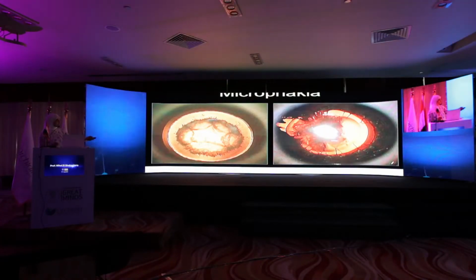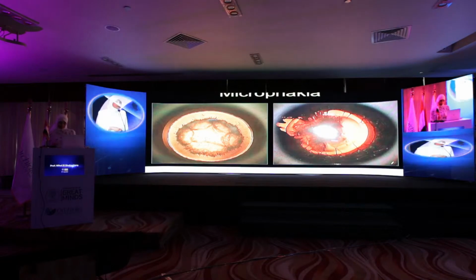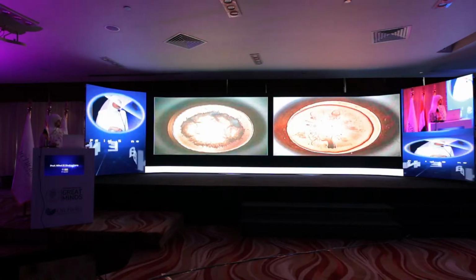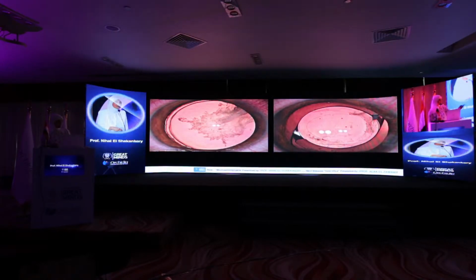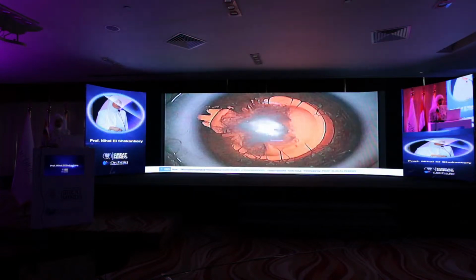To start with, microphakia. Microphakia is a small lens, but not spherical. You have to differentiate between microphakia and lamellar cataract during surgery. Here, this is a lamellar cataract and not microphakia, and here you can see that the lens is in normal place, and here after conventional cataract surgery.